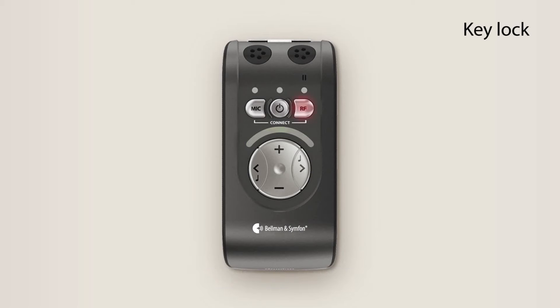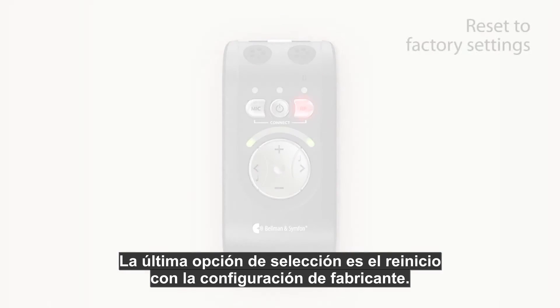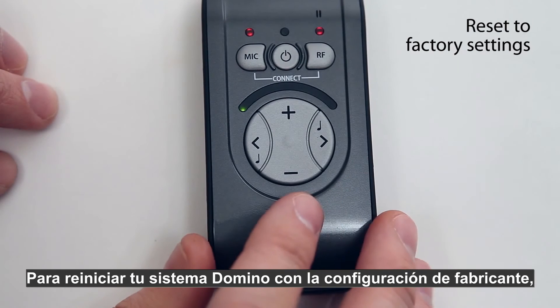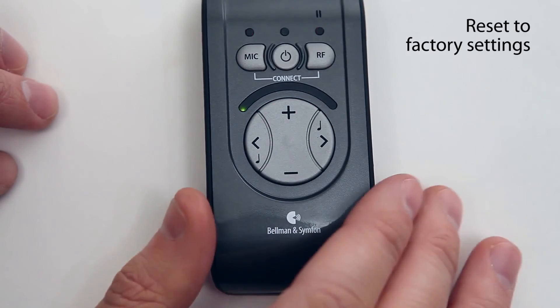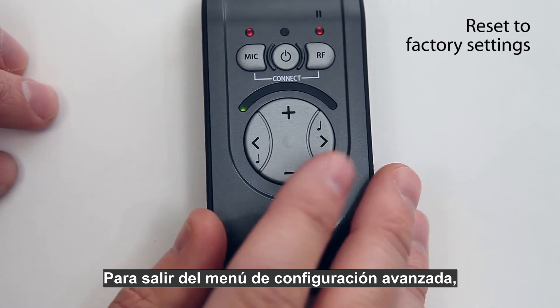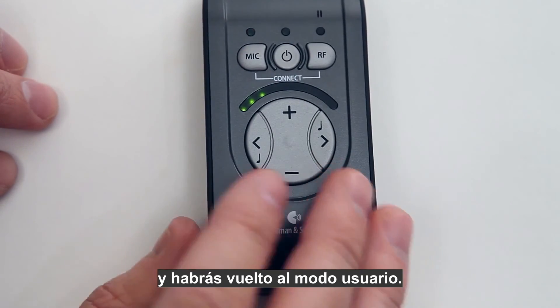The last menu selection is where you reset to factory settings. To reset your Domino system, press and hold the plus button — when the LED ramp is fully lit it will blink to indicate that the product has been reset. To exit the advanced settings menu, press the on/off button once and you are back in user mode.